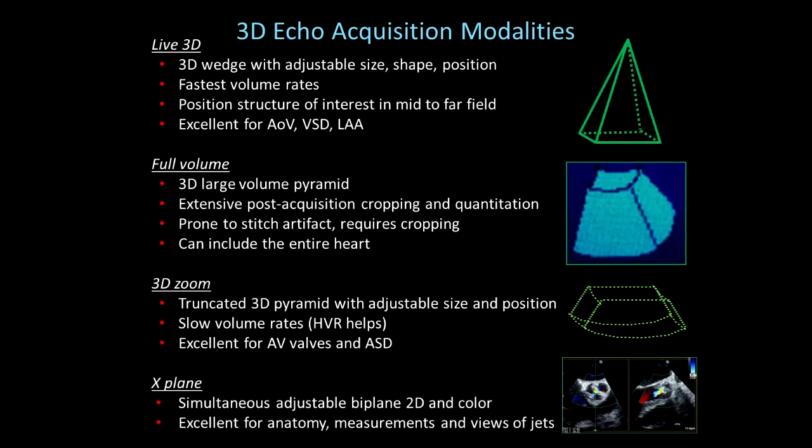3D zoom is excellent for AV valves and atrial septal defects. The fourth acquisition modality is X-Plane, which consists of simultaneous adjustable biplane 2D with color. Just as interventional cath physicians have biplane angiography, we now have live biplane echocardiography with 2D and color. It's excellent for anatomy, measurements, viewing jets, and saving time because we can get two pictures simultaneously.